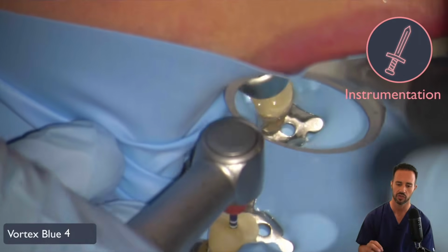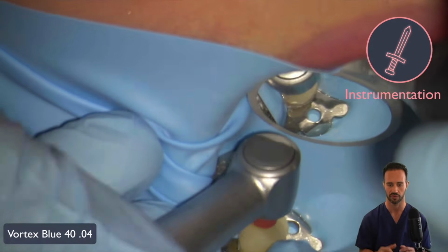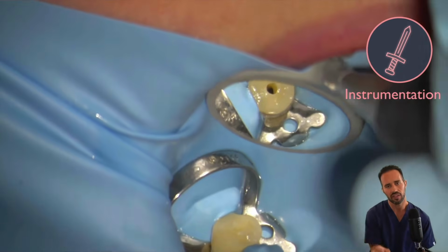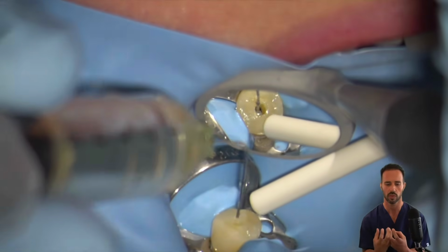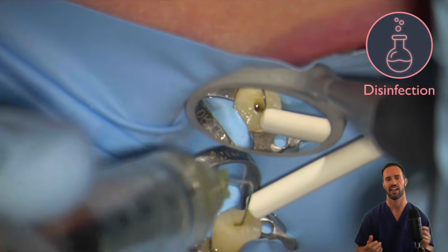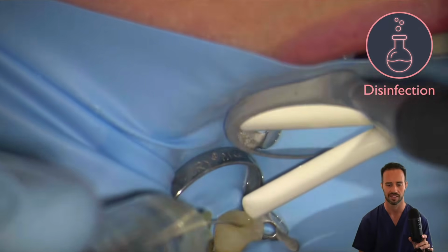And now we're introducing our size 40 Vortex Blue 04 taper rotary file. And that's going all the way to length again. And you can see, I can really feel the file engaging at the apex, which is what we want. We really want that apical region cleaned out. That's going to make all the difference. And that's what's going to give you the confidence to obturate these necrotic cases in a single visit.